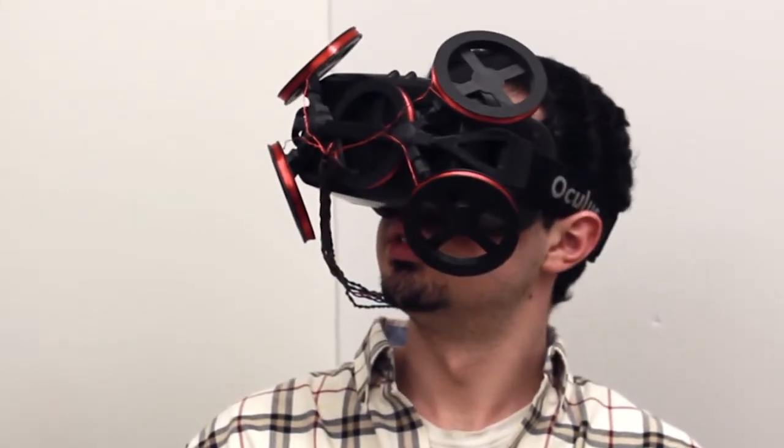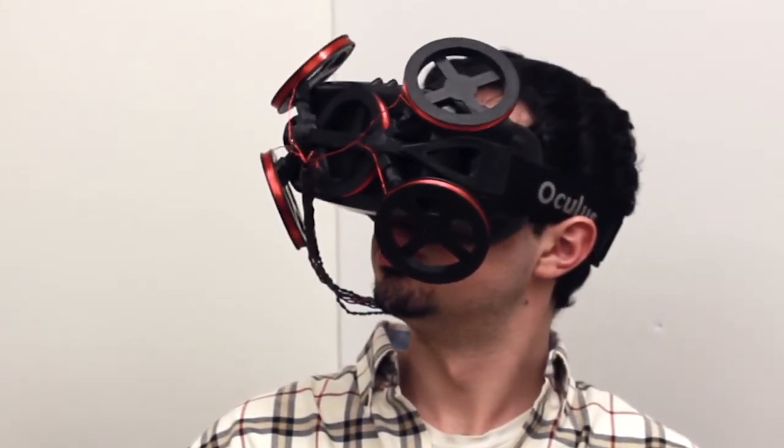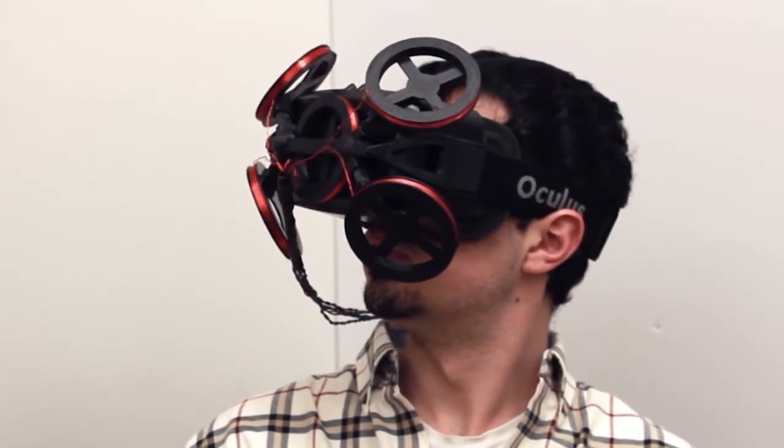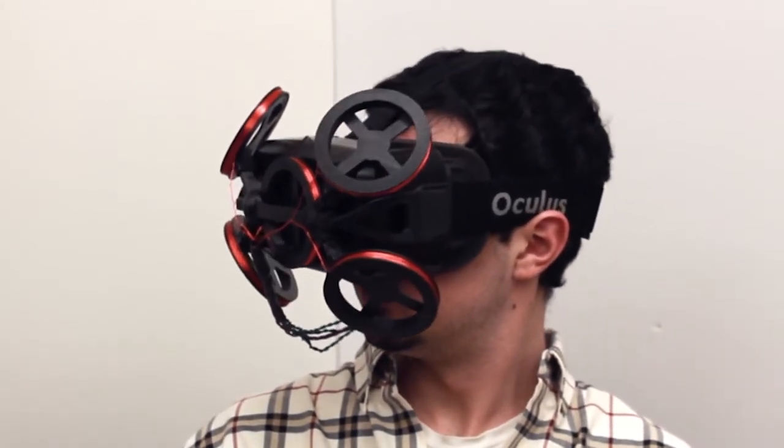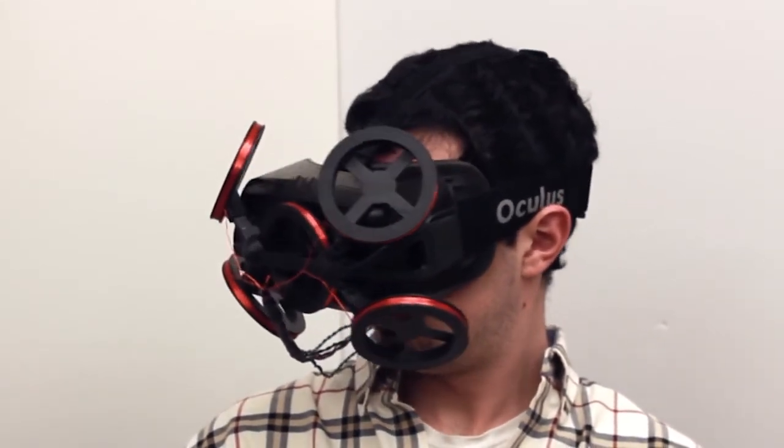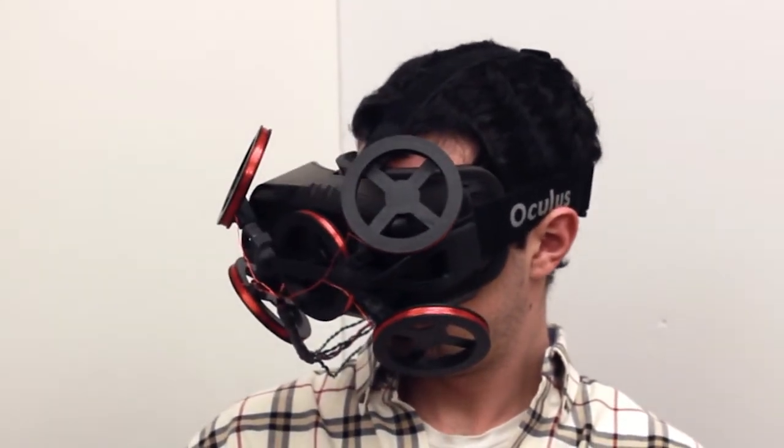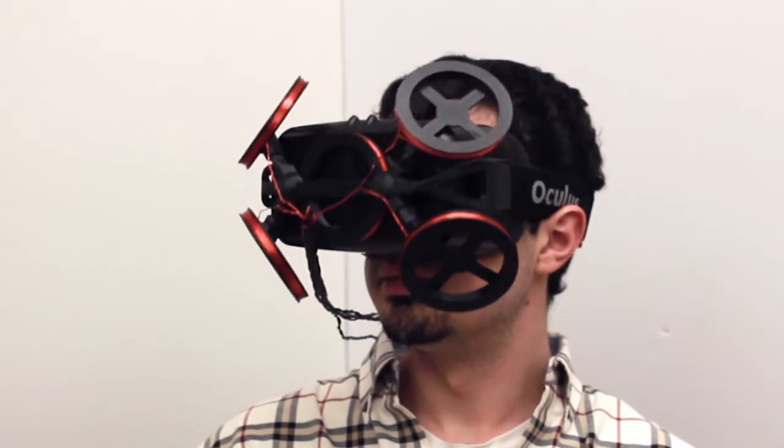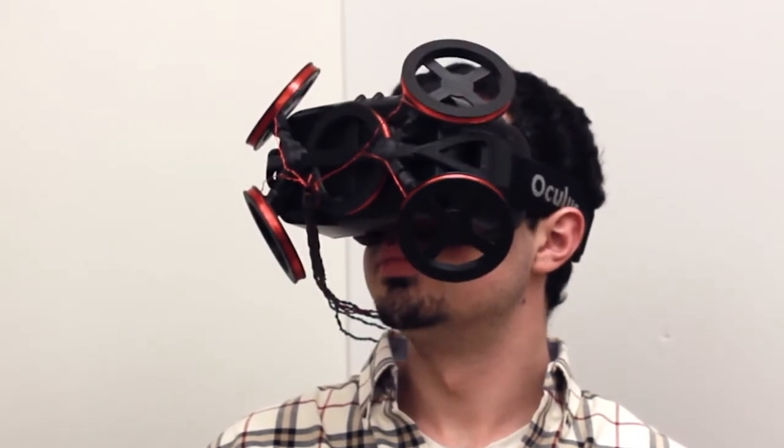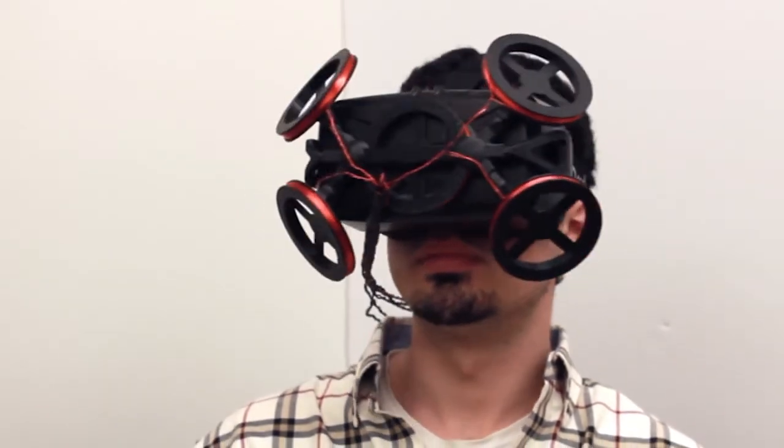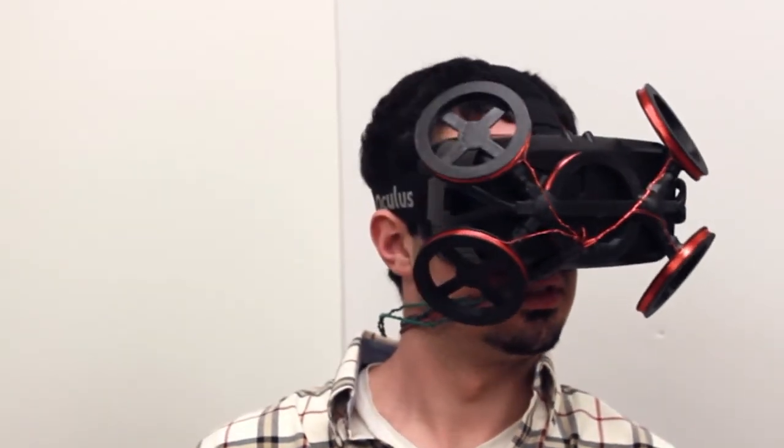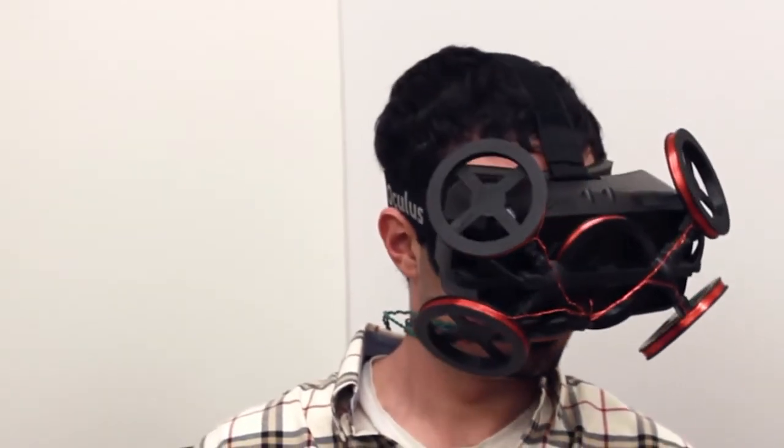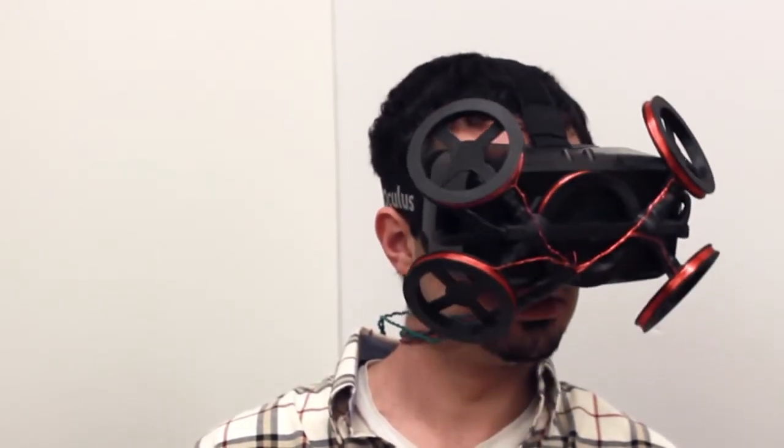EyeContact combines the high accuracy of sclerocoil tracking with the portability of a virtual reality head-mounted display by mounting smaller generator coils directly on the HMD. Our system will allow the user to move about without the need to restrain the head while providing high-quality eye tracking data.